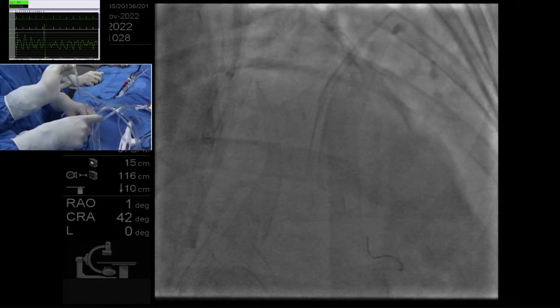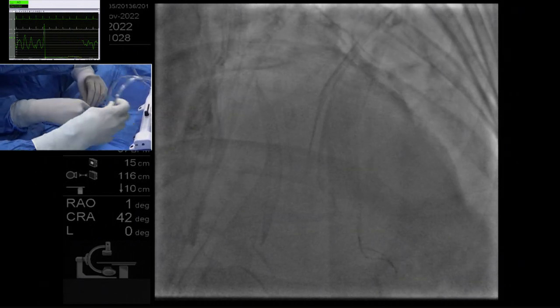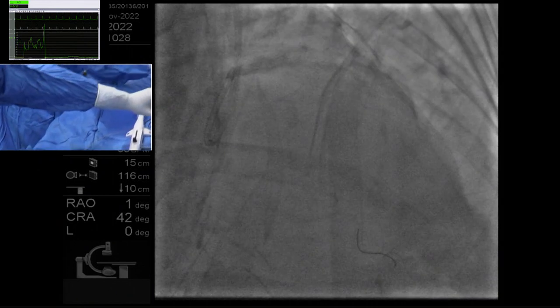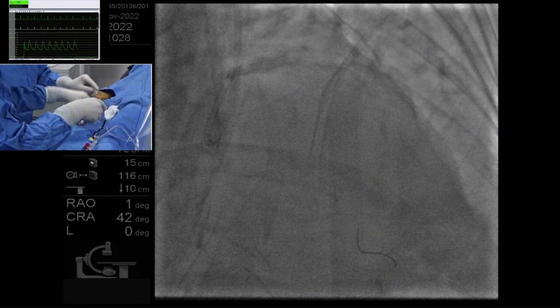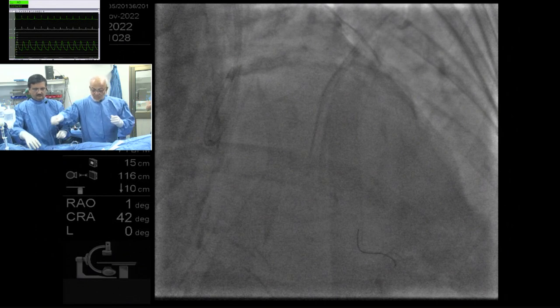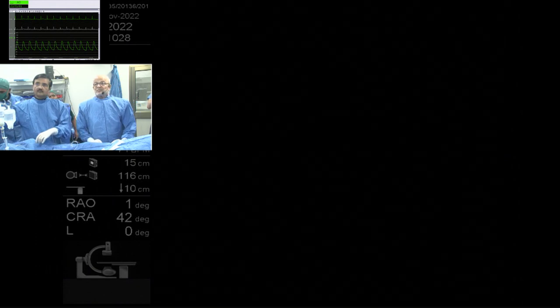But one question, orbital, don't you think it's not that suitable for coronary arteries of this part of the world, very narrow caliber vessels here, right? And with orbital, do you think that might be an issue, the narrow caliber vessels? Like for this, Dr. Patel has chosen a 1.25 burr. Yeah. I think the orbital is okay in this case.